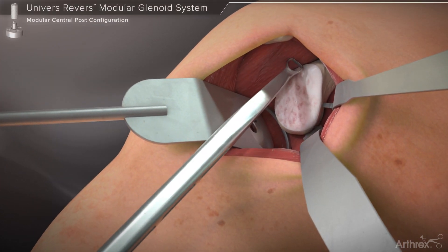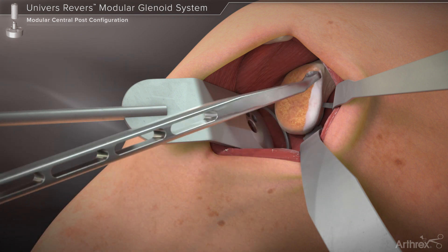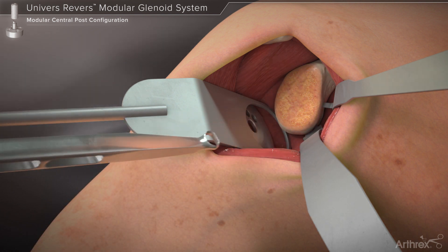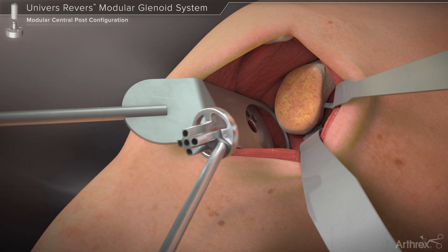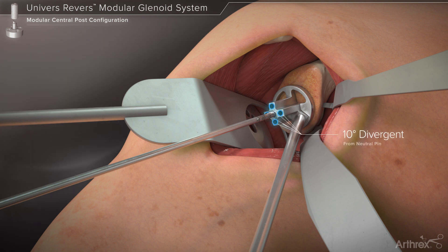The cartilage is removed from the glenoid face using the glenoid scrape pad. The glenoid pin guide corresponding to the desired 24 or 28 millimeter diameter base plate is placed on the glenoid face, and the calibrated 2.8 millimeter guide pin is driven into the glenoid. The central hole within the guide provides a neutral orientation, while each of the four peripheral holes orients the pin 10 degrees divergent from the neutral pin axis.